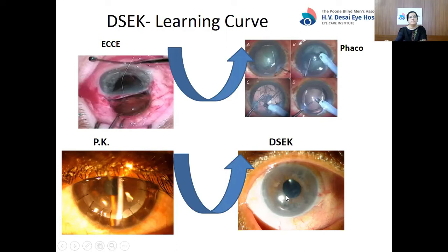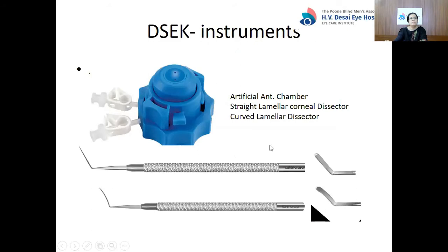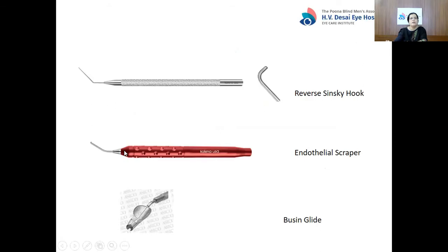These are the instruments required. This is the artificial anterior chamber on which the donor tissue is mounted for dissection. These are the lamellar dissectors — the straight and the curved ones — used for dissection of the donor tissue. This is the reverse Sinskey hook and the endothelial scraper, used for the scoring of Descemet's membrane from the patient. And this is the Busin glide — a variety of endoglides are used to insert the dissected donor lenticule.